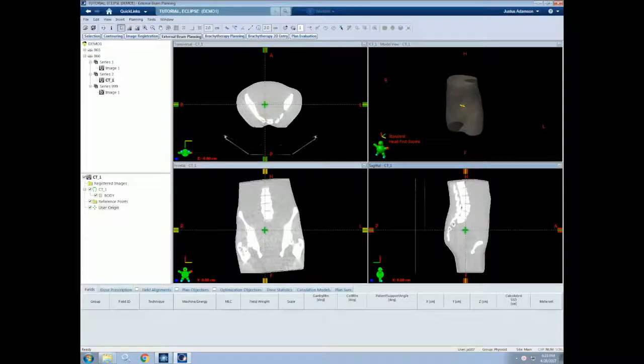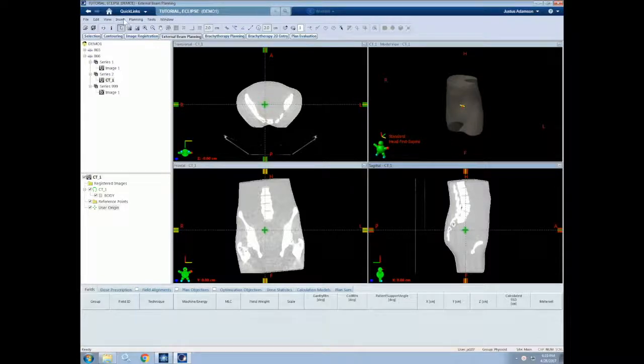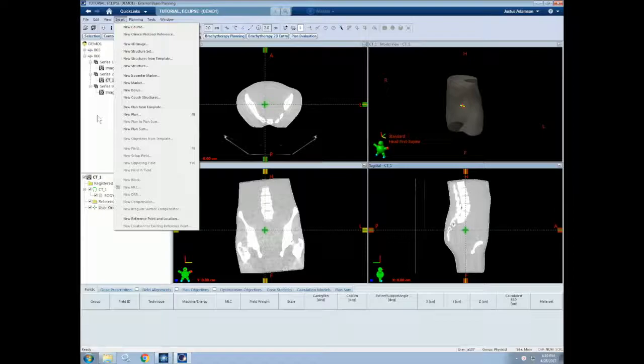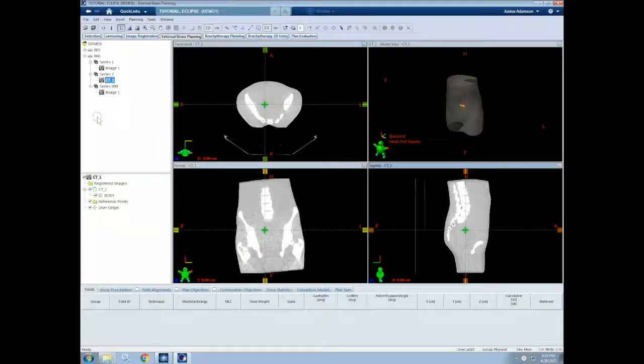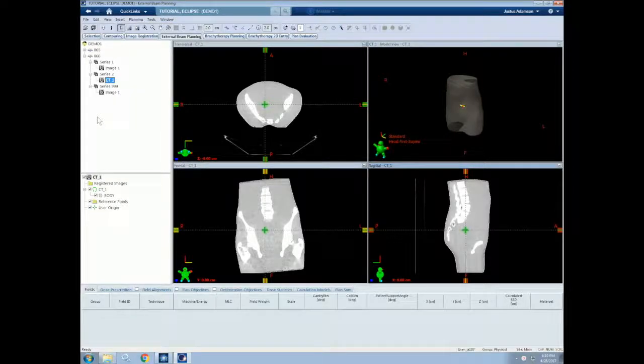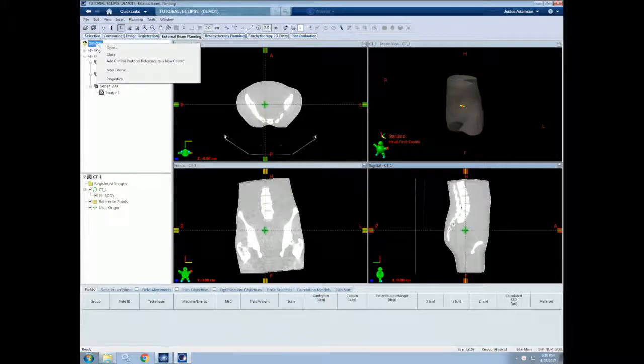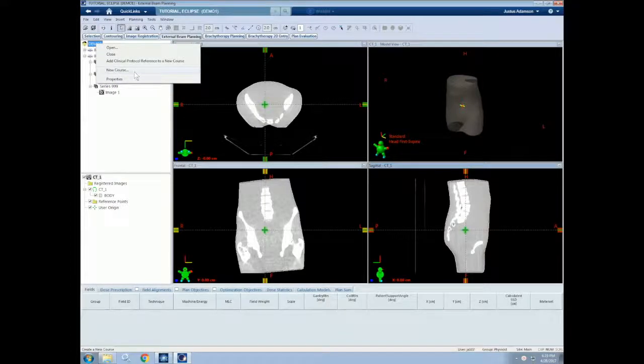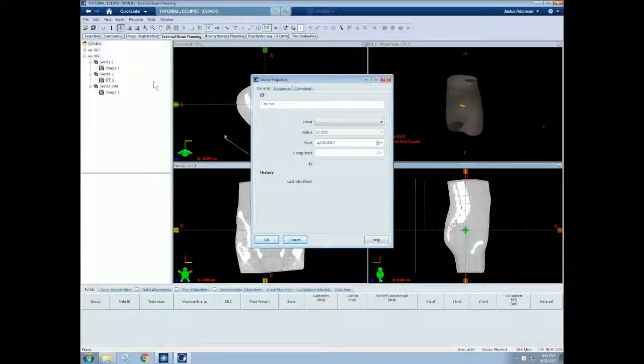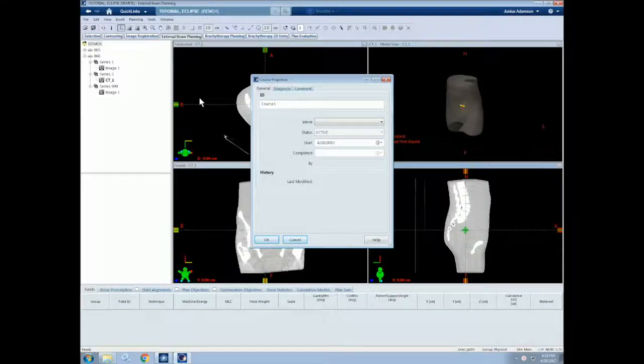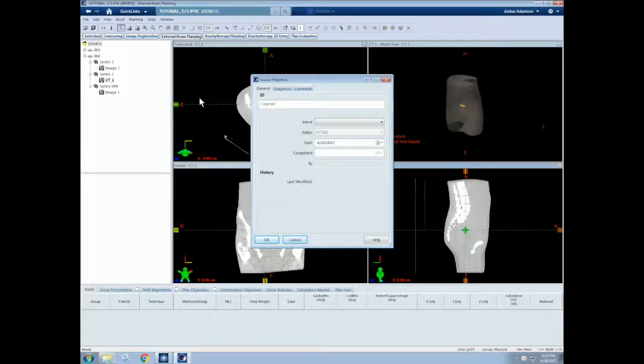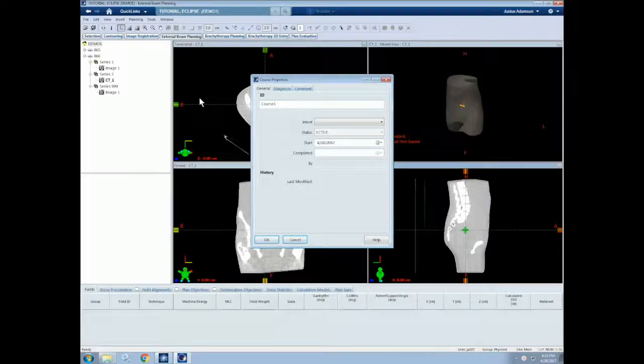We can do this by either going into the Insert menu and clicking New Course, or simply by right clicking on the patient and selecting New Course. Our patient here is called Demo 1. As you will see from these tutorials, there are usually at least two equivalent ways to do everything, and you will choose your preference as you get more familiar with the software.